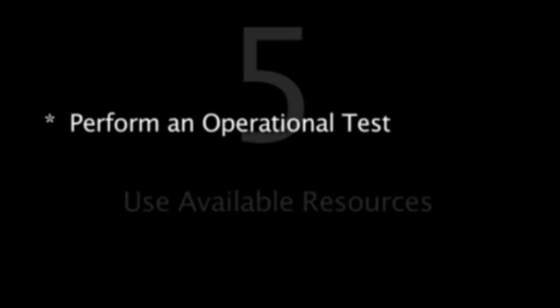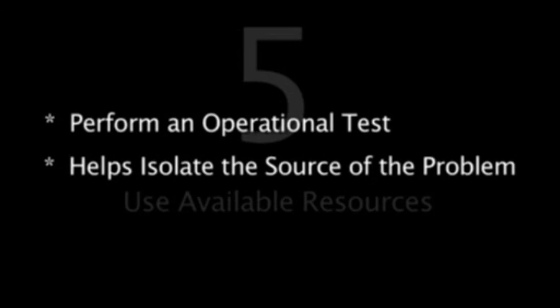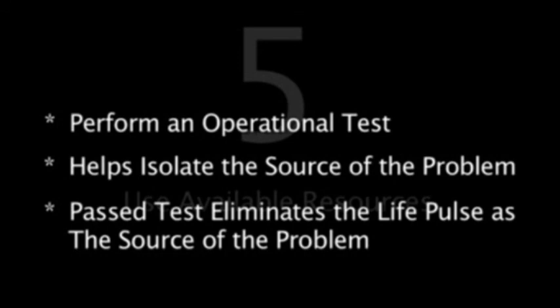If an alarm condition cannot be corrected easily, perform an operational test. If you've done the self-test, the next step is to do the operational test. This step can help isolate the source of the problem. If the LifePulse passes the operational test on a test lung, the cause of the alarm has to be in the ET tube, the conventional ventilator, or the patient.